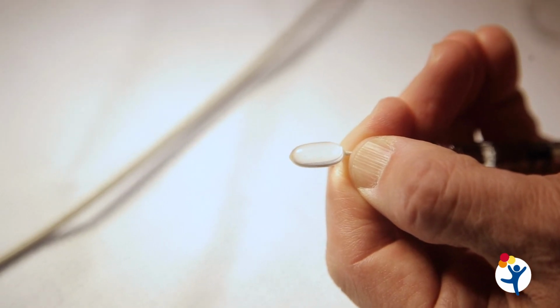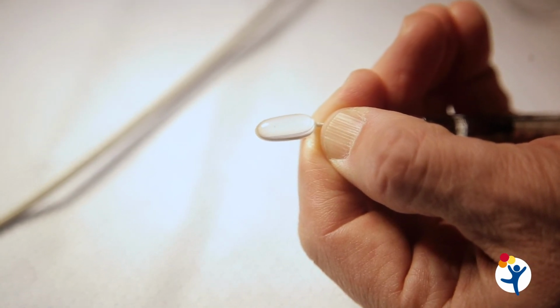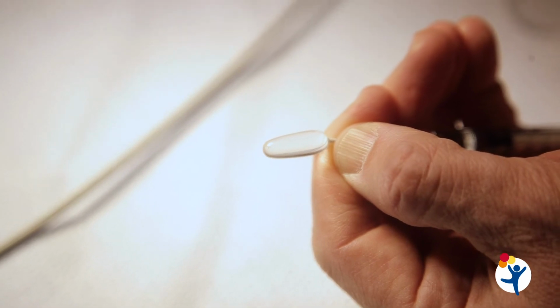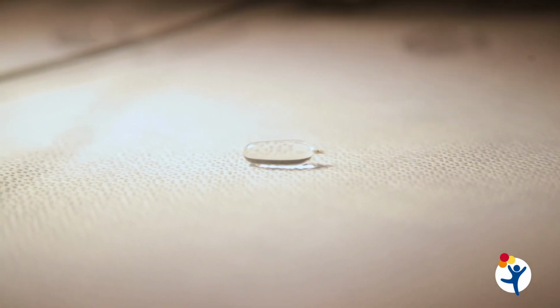At 34 weeks, the balloon is either deflated by a needle procedure or by a repeat fetoscopic procedure. In the event that this does not occur, an exit procedure may be required. The reason the balloon needs to be deflated prior to delivery is that surfactant production does not occur when the balloon is in place. By releasing the plug, surfactant production commences. This plug and unplug sequence was borne out in the animal model.